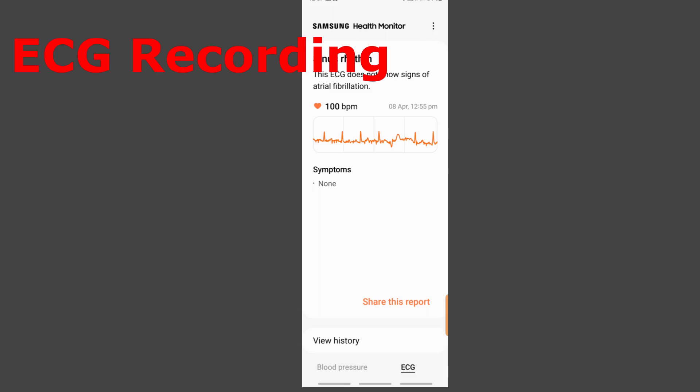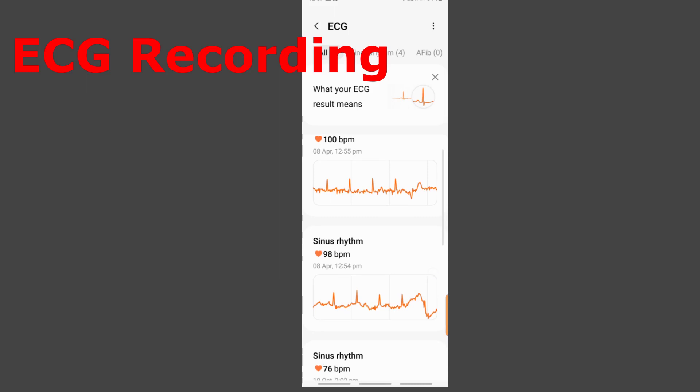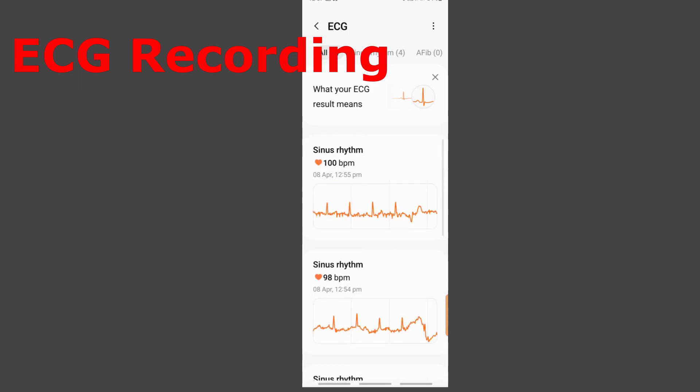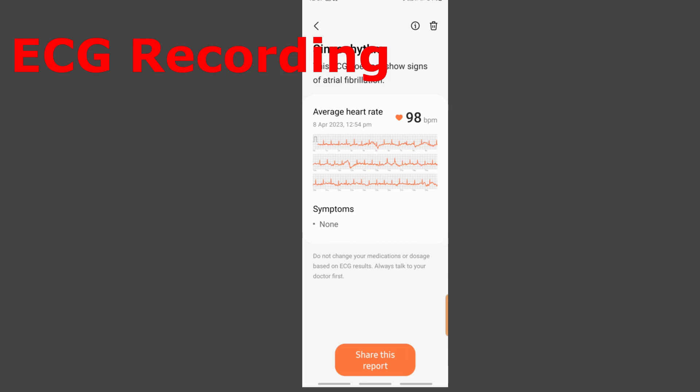The previous screen shows your latest reading, but going into history shows all readings. I had taken two readings and both are displayed. Clicking on any one of them gives a more detailed chart with heart rate, any recorded symptoms, and you can share that individual report as well.